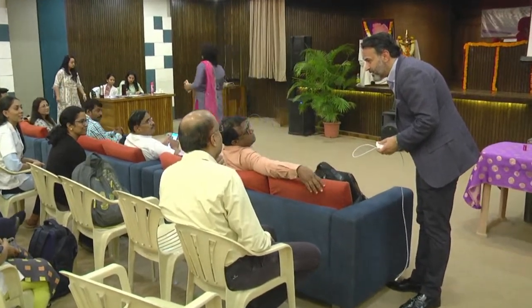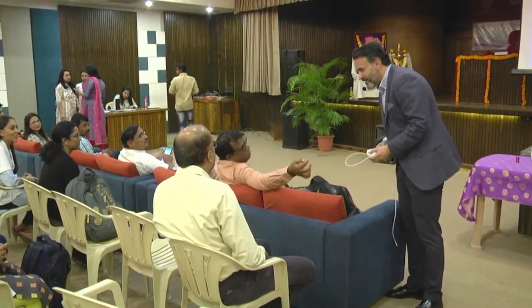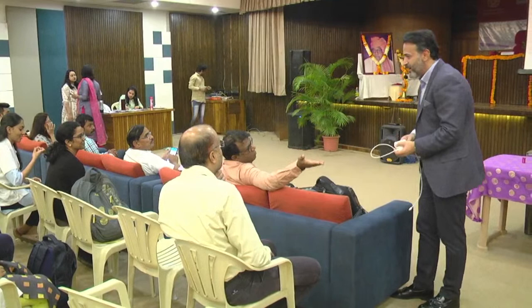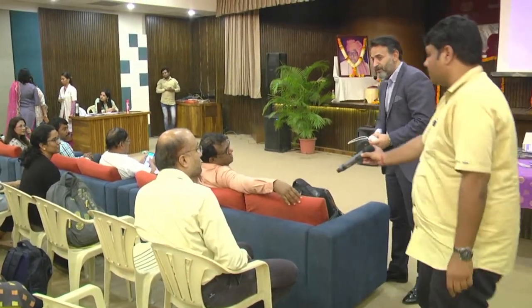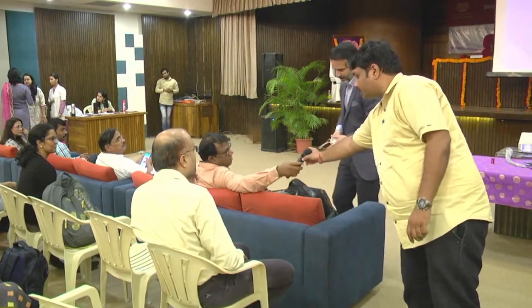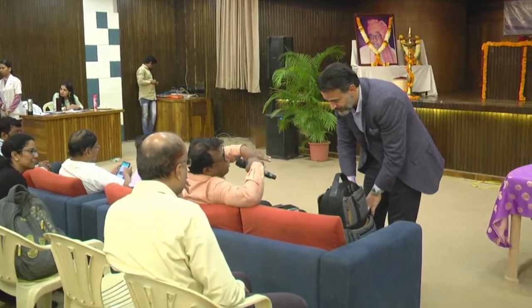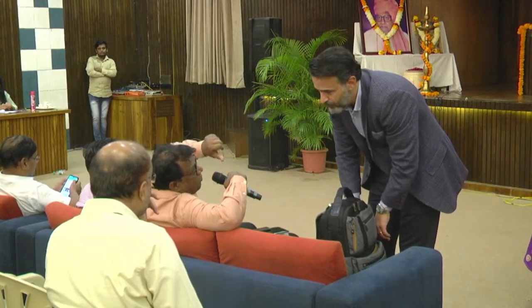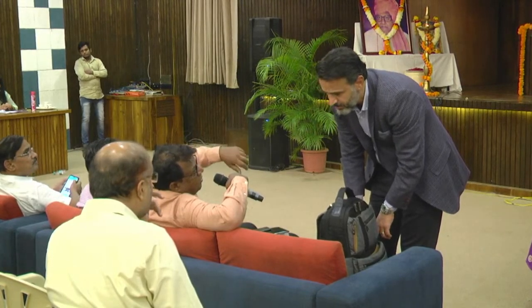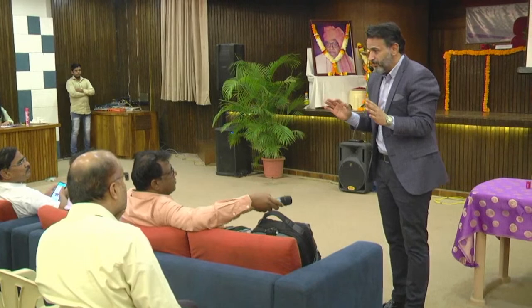Proprioception in future? Yes. Sorry, I couldn't understand the question. I'm sorry. Can you please tell me again? That proprioception you told initially, that we are lacking behind in relation to proprioception due to the guide. Okay, let me answer. Due to having an open view system, it's not a closed tray-like shaped guide.